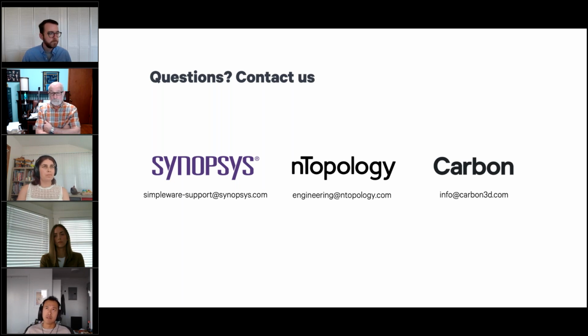In terms of the clearance and validation side of things, nTopology as a software platform or software package is not pre-validated in any way. Typically, those who integrate the software into their design workflow are going to be validating from a larger or grander scope as a part of that workflow. That's typically the most seamless way to implement this kind of geometry generation into the workflow, and that's been successful for us so far. If you have any further questions, feel free to send me an email. We can talk about it more in depth.